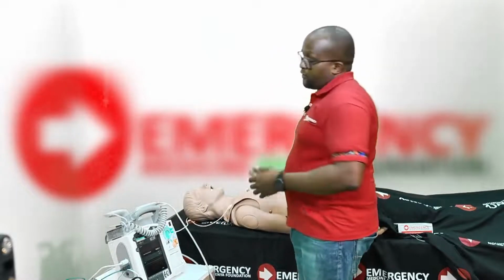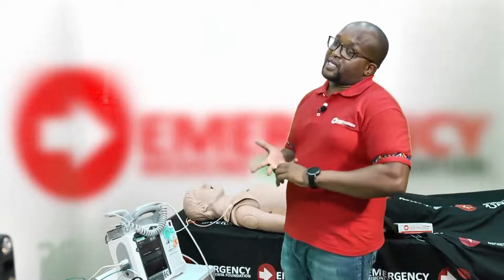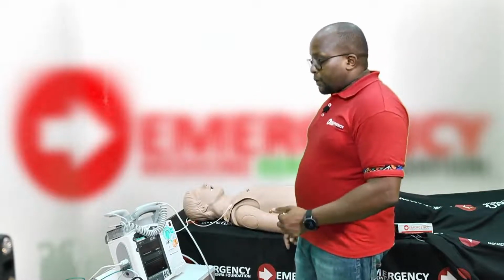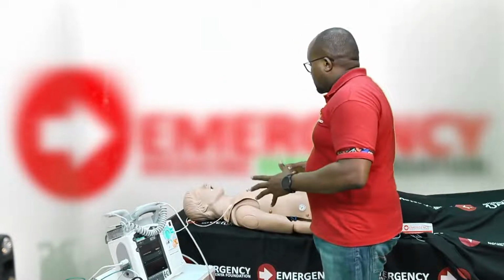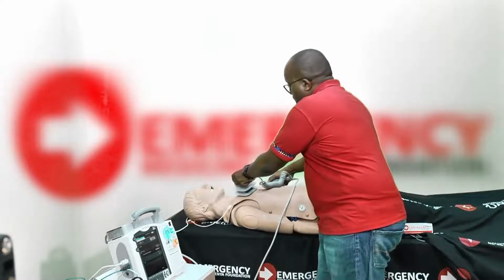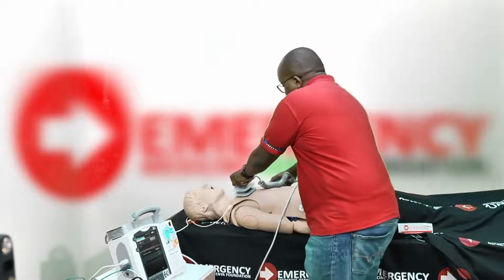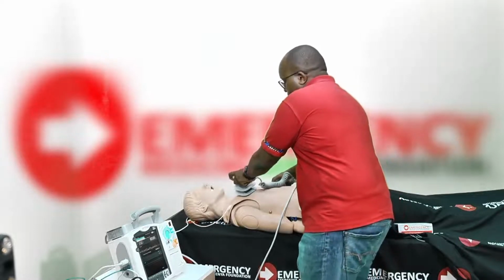The other aspect of it is in the new guidelines, the recommendation, remember, as I said, is you want to minimize interruptions. So the option for minimizing interruptions is, for example, if you know the patient is in ventricular fibrillation, or we're getting there, having the paddles already ready. So someone is doing CPR, you're having the paddles ready so that the moment it's a rhythm check, stop CPR, check rhythm, charge, and shock the patient if indicated.